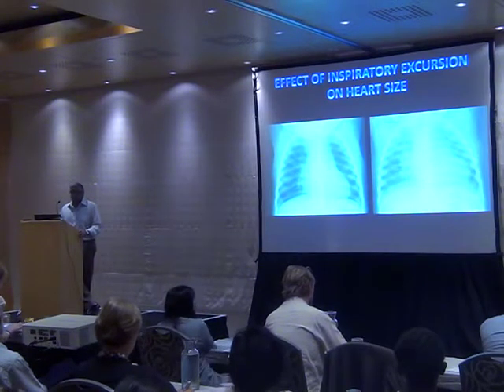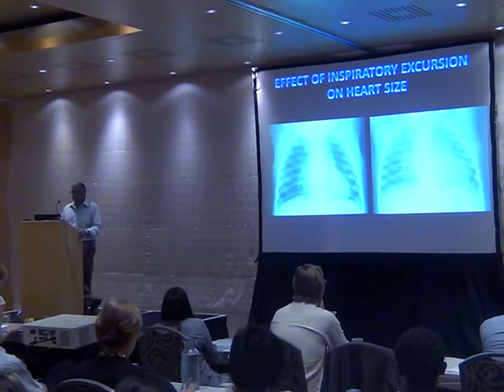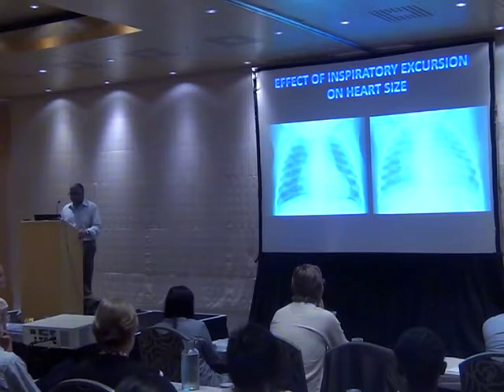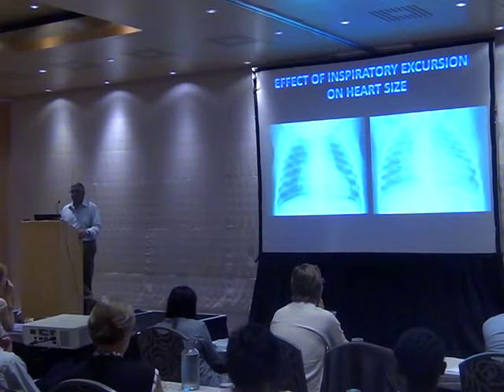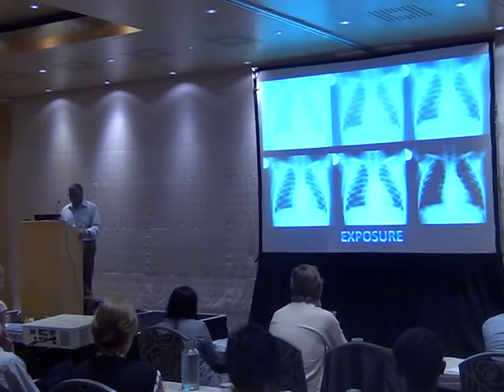Here are two radiographs of the same patient illustrating technical issues that might give rise to erroneous interpretation. On adequate inspiration, the heart appears normal. On poor inspiration, we have a big heart, exaggerated parahilar bronchovascular markings — people might interpret that as pulmonary plethora and ascribe an underlying congenital heart anomaly.